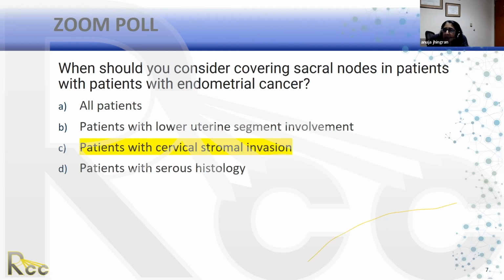So any answers? The answers are coming in on the chat. Someone said pelvic nodes. Another answer is the para-aortic nodes. Yes, PA. Lots of PA answers coming in. And that's absolutely true. If there is fundal involvement, the risk for a PA node right underneath the renal vessels is going to be high. So great, you guys know this.